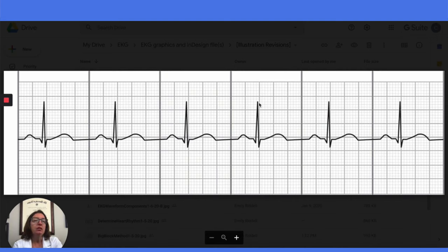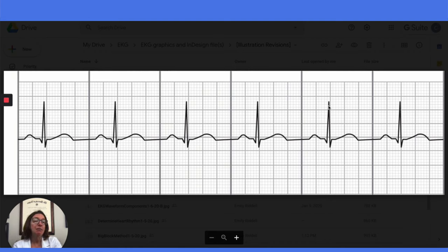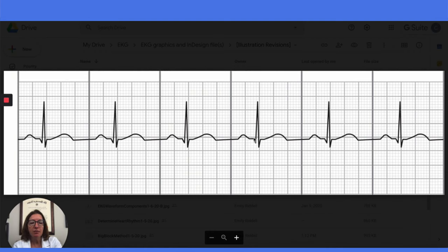So we would use the small box method to calculate the heart rate. In between these R-waves, we have 25 small boxes. So if we take 1500 divided by 25, we get 60 beats per minute. We can see that all the P-waves are nice and upright and uniform in appearance. There is one P-wave for each QRS complex. And if we measure our PR interval here, we will see that it is within the range of three to five small boxes, and the QRS complex is nice and narrow — it is under three boxes wide.